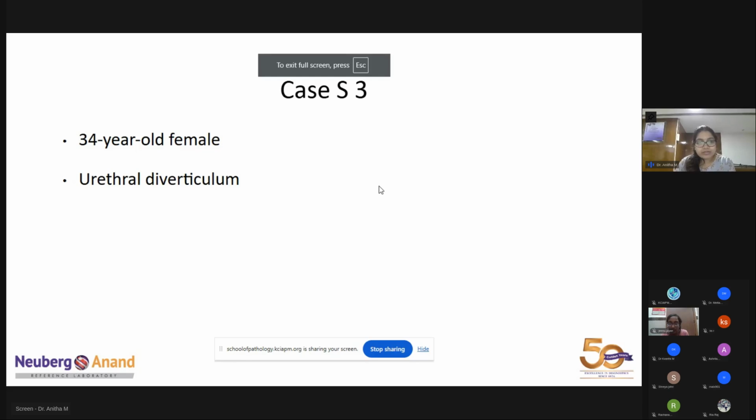What other stains would you like to do for the Michaelis-Gutmann bodies? Ma'am, Prussian blue, ma'am. Perls or Prussian blue. That will stain for iron, and von Kossa will stain for calcium, ma'am. It is an iron and calcium mixed material, ma'am. Do you find any sheets of histiocytic aggregates in the section? In some places, I have noted, ma'am, sheets of histiocytic aggregates.